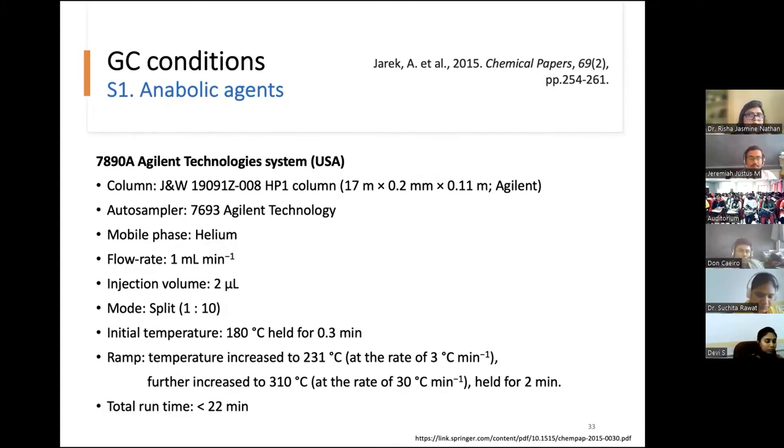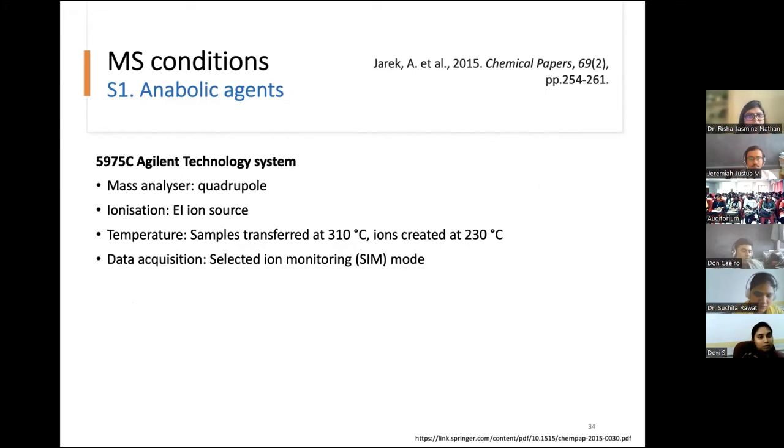So the way it is done in these labs, they will inject the sample and leave the sample overnight. The instrument is going to run the samples the whole night, and then in the morning we come and we get the data already. Okay, so that is programmed that way. Injections are usually done at night or in the evening.